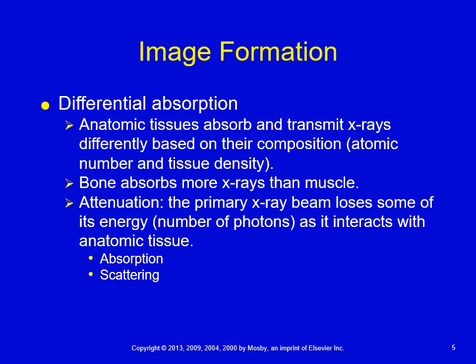The air within the lungs allows the X-rays to penetrate through easily. That's why you see the darker shades. Dark means that the X-ray beam got through unimpeded and was able to interact with our image receptor. The white areas that you see, the ribs and also the spine, are composed of a higher atomic number. They're thicker, more dense, and they attenuate more of the X-ray beam. So that's why they appear lighter, brighter, or even whiter on the X-ray image.